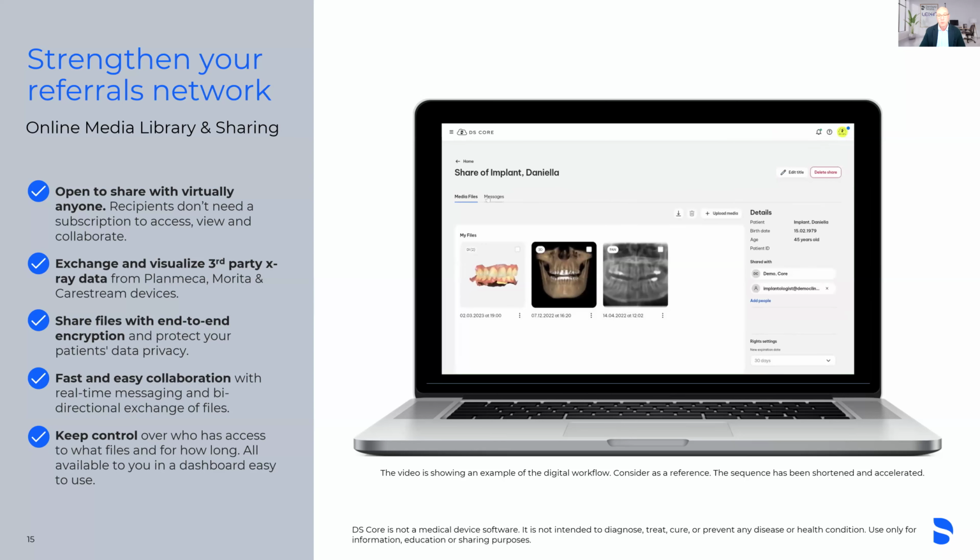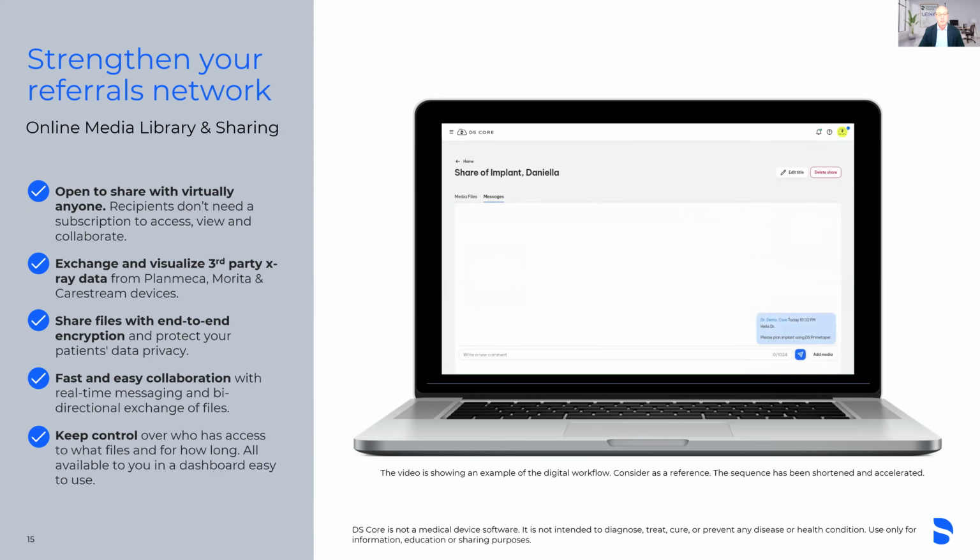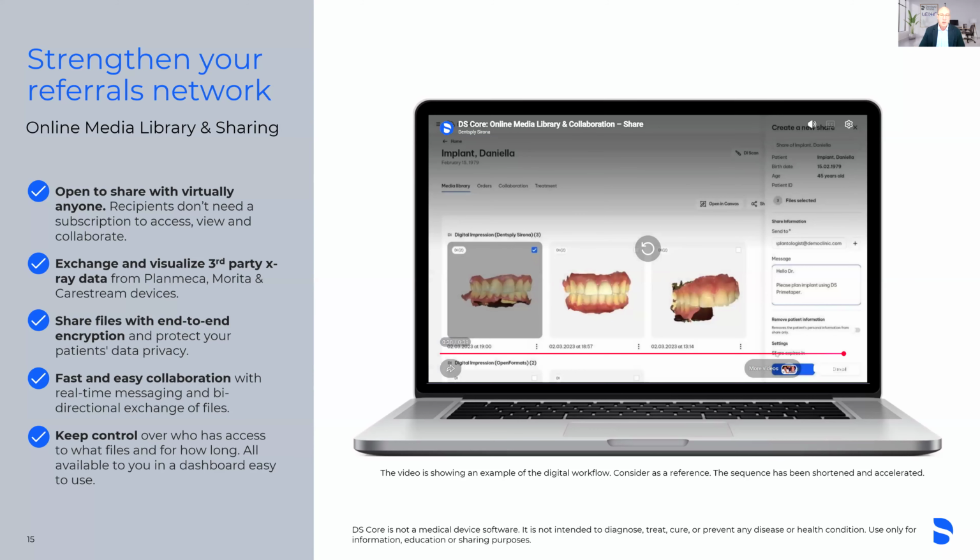And really, where this takes place in real life is there's no more software versions or readers or thumb drives being passed around. So you have a HIPAA compliant way of sharing data with all of your referral networks. That's very fast, it's easy, and then there's also chat functions built in to where you can chat back and forth as needed through your media library.